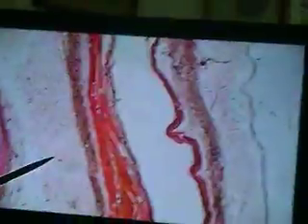Alright. This one I'm not too impressed with. It's quite a massive trachea. Let me use something a little smaller. That one is really large. That one must have been maybe from a human. That's very, very big. Let me go down to a smaller scale. Alright. So there we see now the trachea right here, juxtaposed with the esophagus. Okay, lots of glandular tissue.